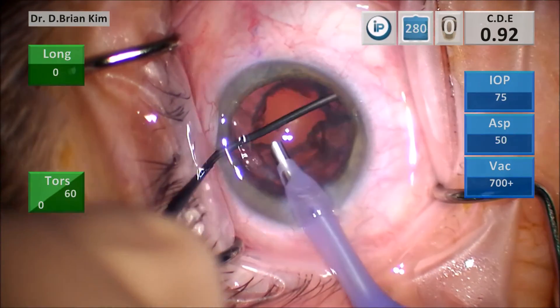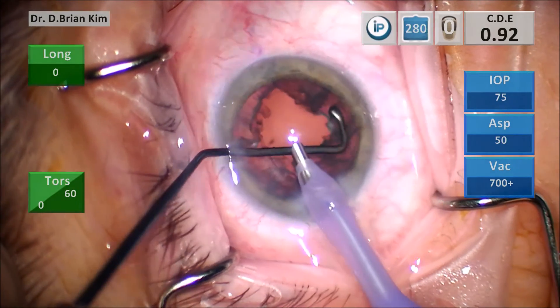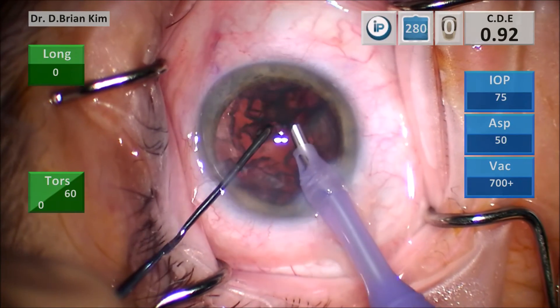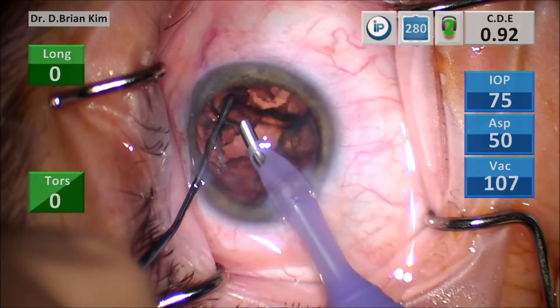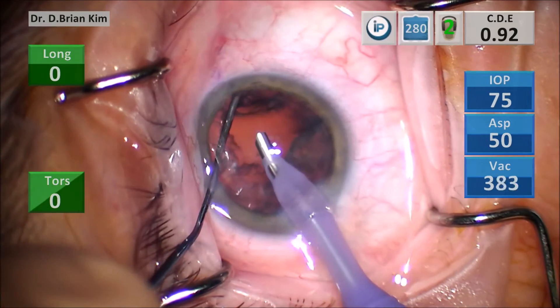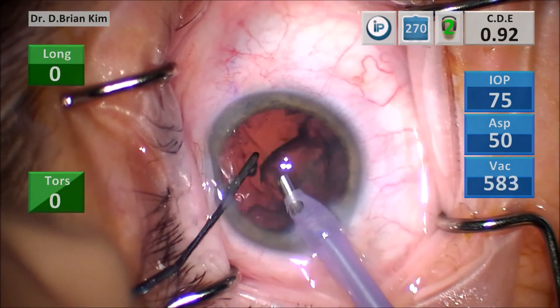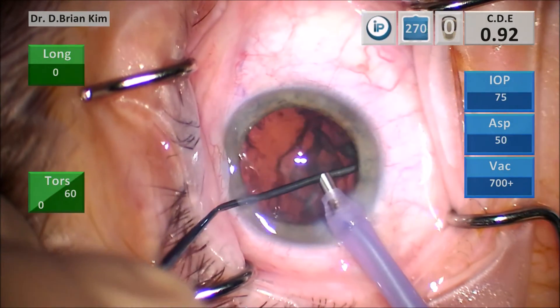I do the same maneuver mobilizing a hemi epinucleus. For one large piece of epinucleus, I make sure I'm parallel as I go out, then rotate to pull the epinucleus centrally. Don't give up if you have difficulty — keep at it. As you tease an edge of the epinucleus and grab with the phaco tip, the rest starts cascading out very easily.